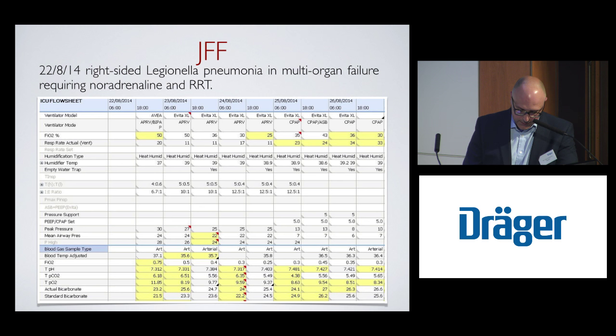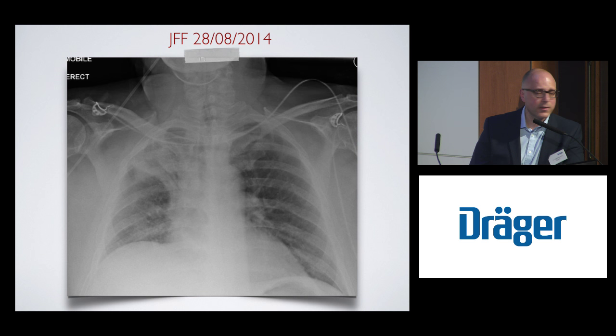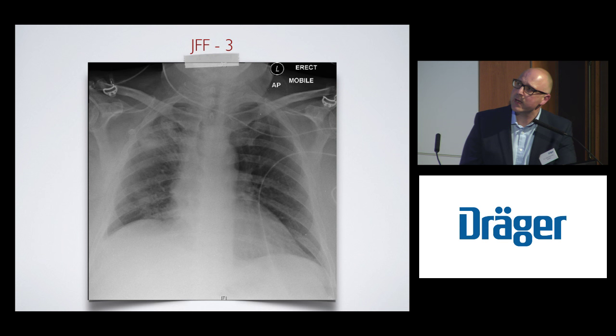And this was her chest x-ray. So you can see it's fairly unilateral disease. So it's not the classical diffuse bilateral pulmonary edema or infective pulmonary edema. And this is a few days later, it starts to clear and then clears again. And obviously that will track the improvement in gas exchange.